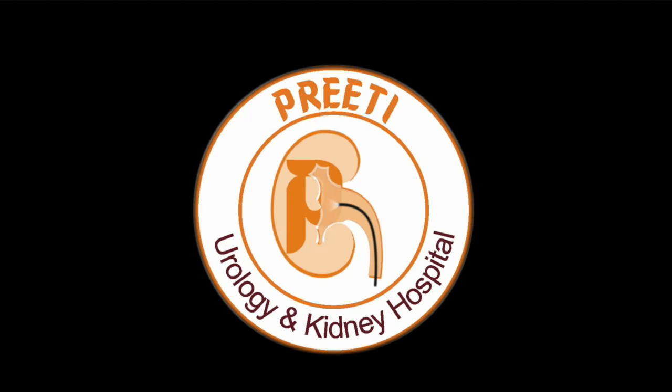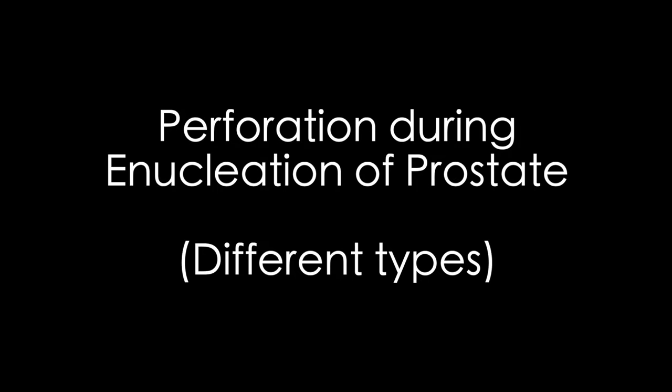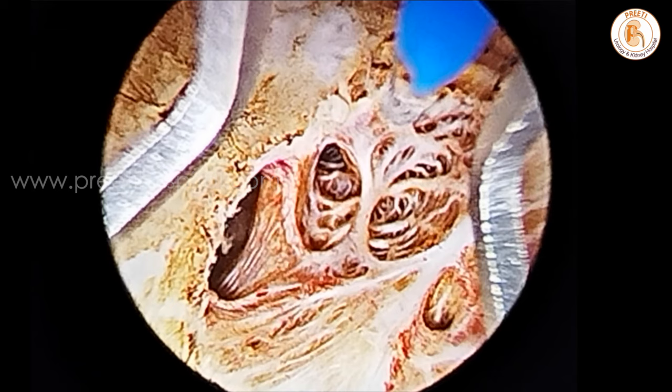Here is a small video where we are sharing different types of perforations during enucleation of the prostate. Usually if you go close to the gland it appears charred in TFL. If you go close to the capsule, perforations happen. So you have to be experienced and also keep the laser fiber a little away when you are using high voltage.